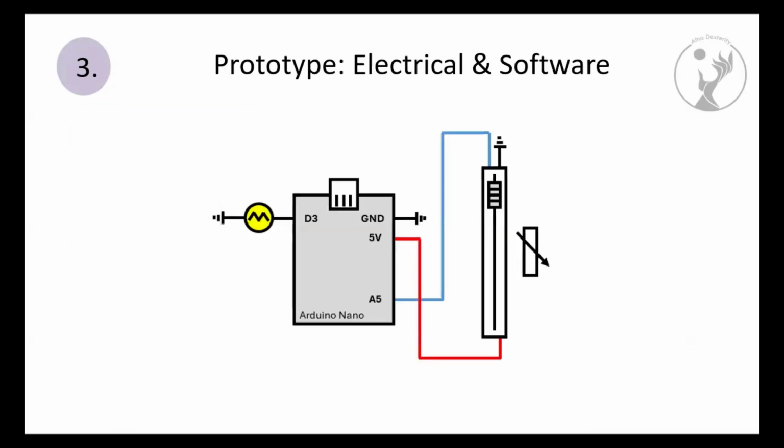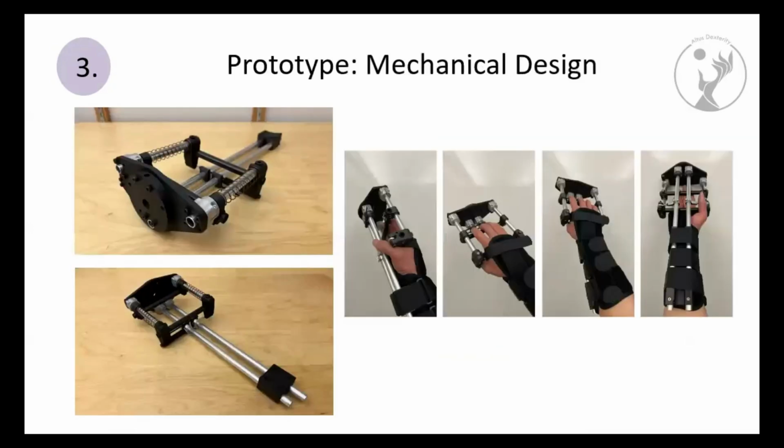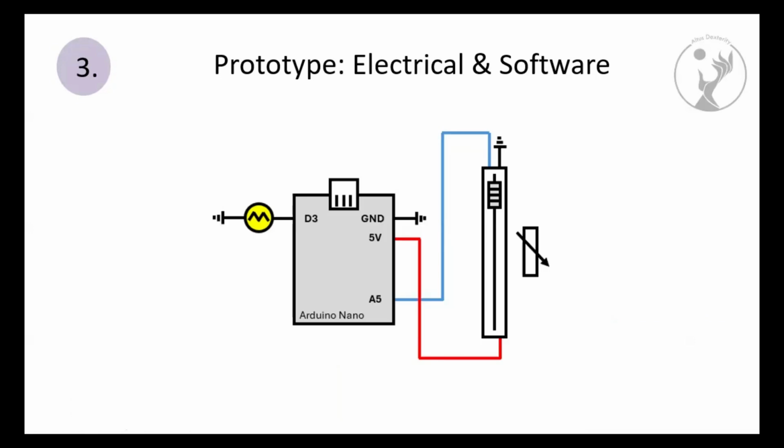Then from there, we also made a circuit. The circuit is just a simple potentiometer attached with the knob in this gripping part. So when you move it back and forth, it moves the potentiometer value back and forth. And based on this potentiometer value, we will send it back to the hand to control the grasp. We also added an LED through a digital pin so you could see how this potentiometer affects the circuit, as well as if it's getting properly sent through. We used an Arduino Nano to send this signal back to the computer so that we could use it.